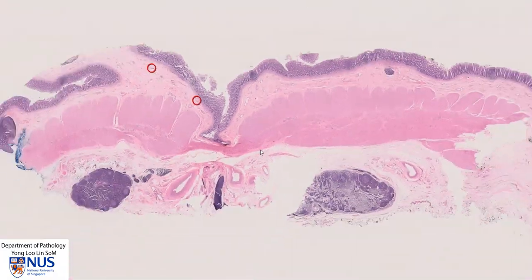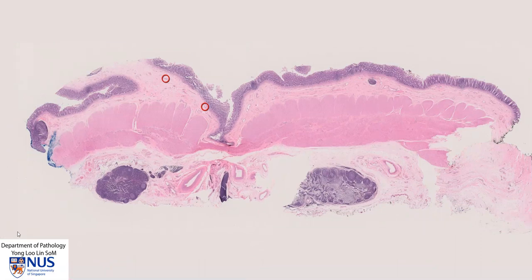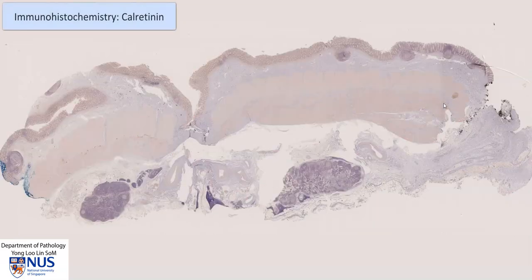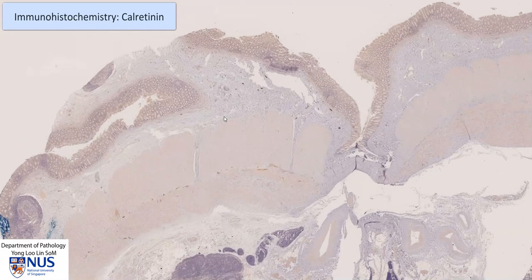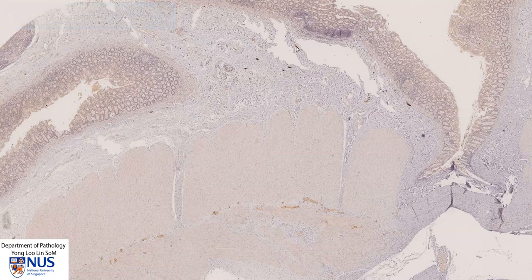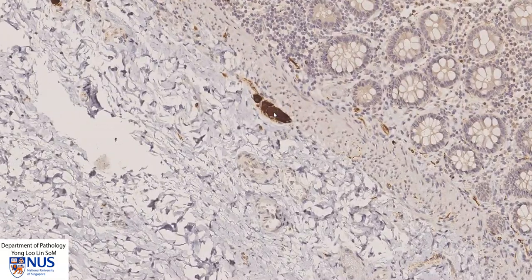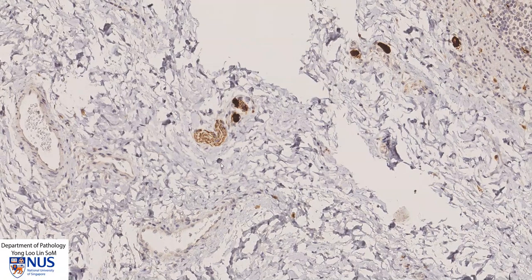We can also use a particular immunohistochemical marker to help us identify these ganglion cells, known as calretinin. Here is the section stained with calretinin antibody. This is the abnormal segment and this is the normal segment. Already at low magnification, we can see dark brown positive staining regions in the submucosal nerve twigs and also in the myenteric plexus. Zooming in, these very plump cells are the ganglion cells, and these are the nerve twigs — both are positive for calretinin. Similarly, in the myenteric plexus, we can see nerve twigs or nerve bundles that are positive and also ganglion cells.